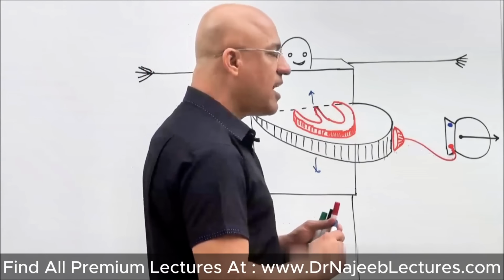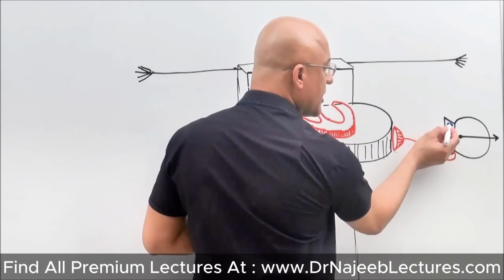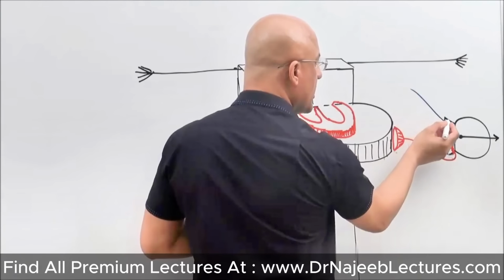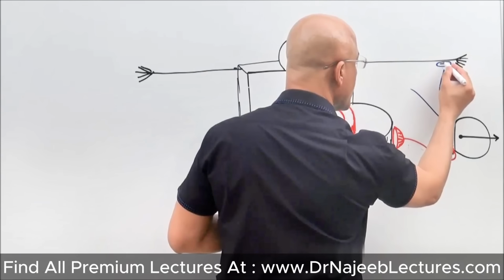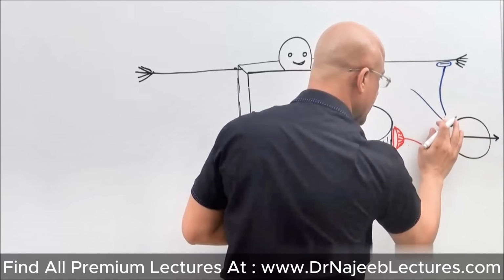The answer is the negative terminal. It is connected through a common terminal. Okay, I must make it clear.